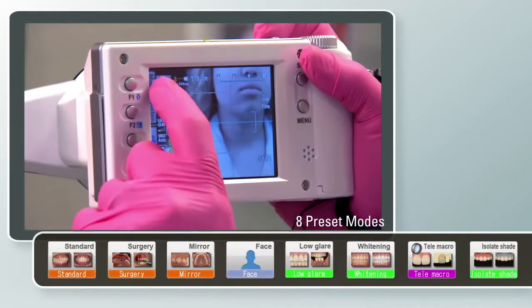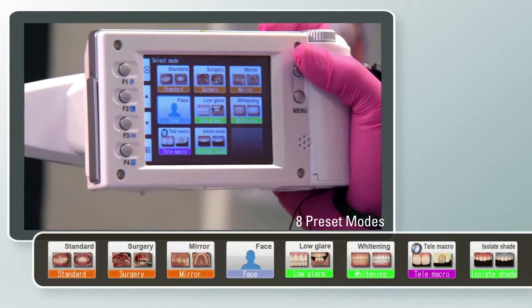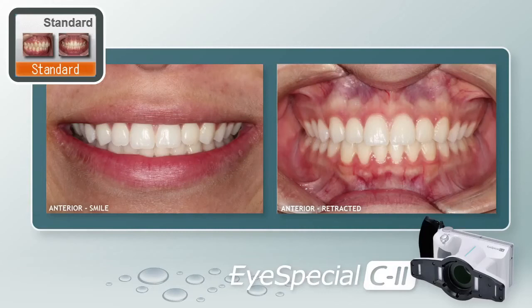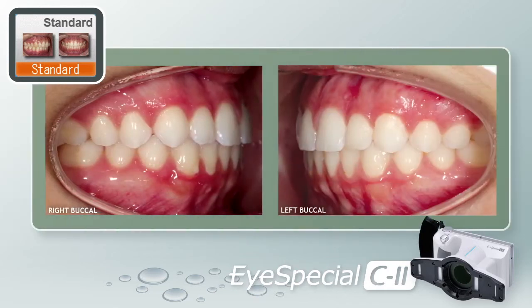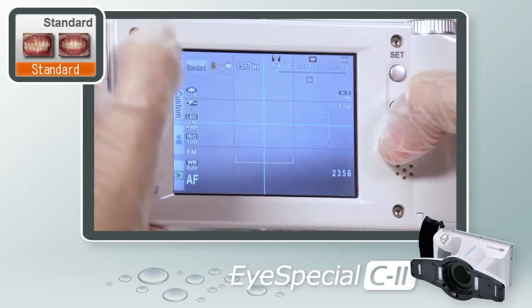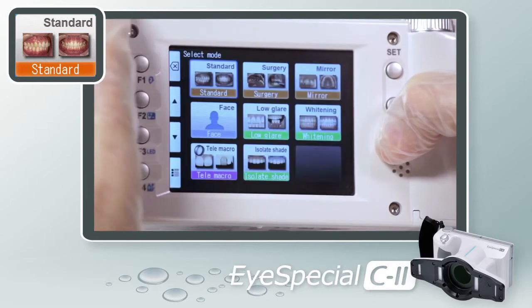The iSpecial C2 comes with eight preset dental shooting modes: Standard, Surgery, Mirror, Face, Low Glare, Whitening, Tele Macro, and Isolate Shade. Selecting Standard Mode: you can take the majority of your images in standard mode, including anterior and retracted smile, as well as left and right buccal shots, from various ranges to achieve the desired photo. Press the F1 key or touch the mode button in the top left corner, then select Standard Mode.